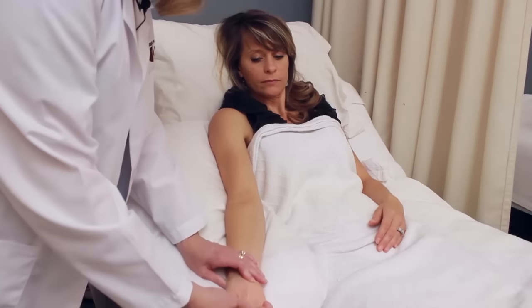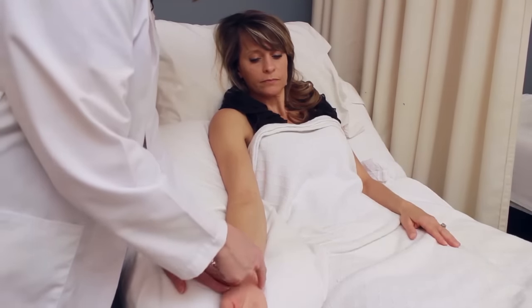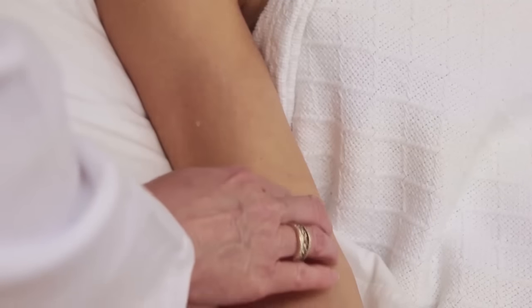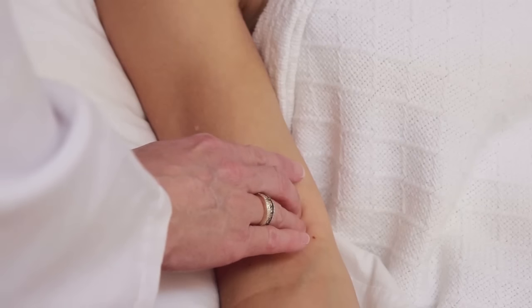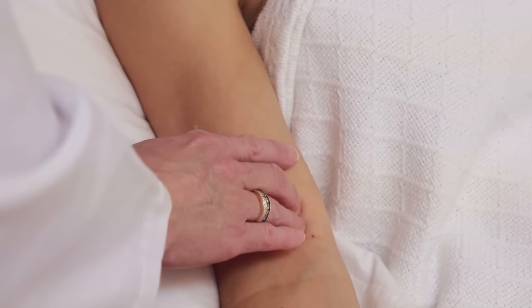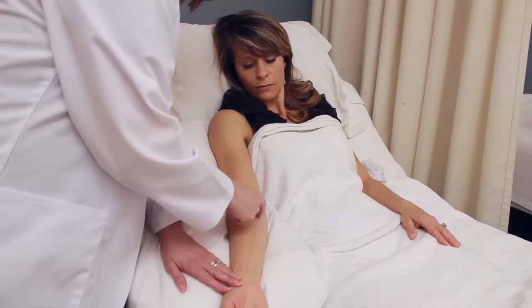To locate the brachial artery, the easiest way is to draw a line up the pinky above the bend of the elbow. That's where you'll position your cuff arrow, and that's also where you'll place the diaphragm of your stethoscope.